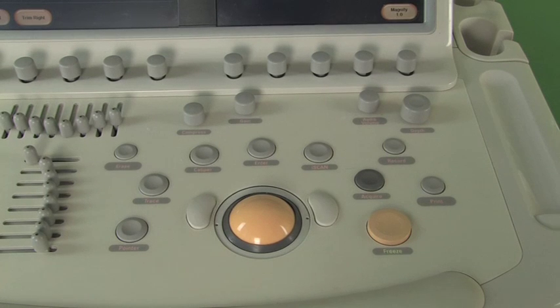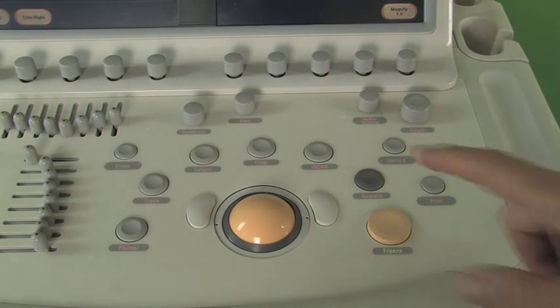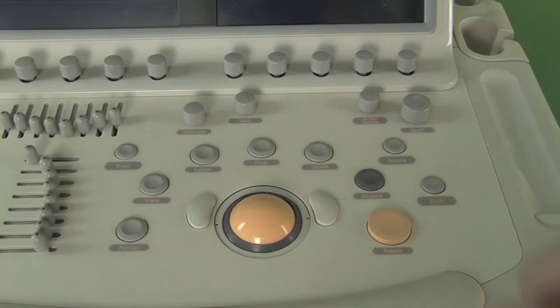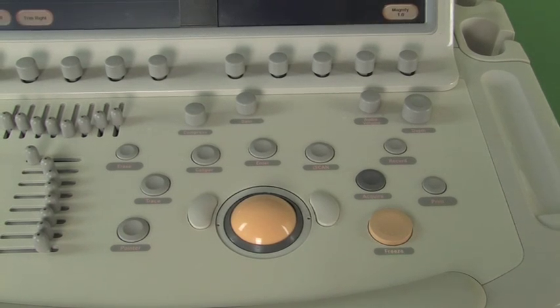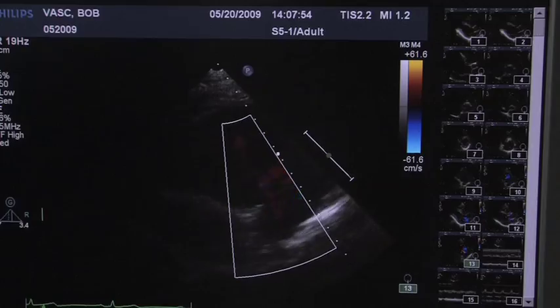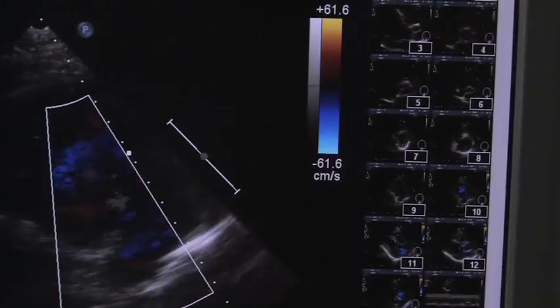We can now record on videotape, or go ahead and hit the acquire button for this, and it will put it into the memory. And then let's take a look on the screen. You can see on the right are all those images that we acquired.